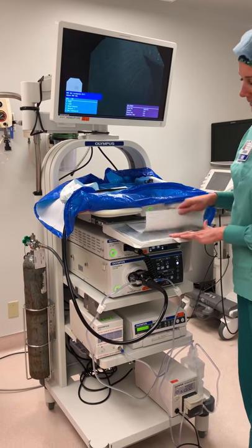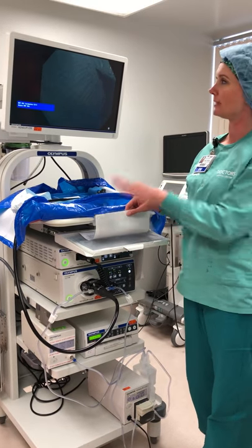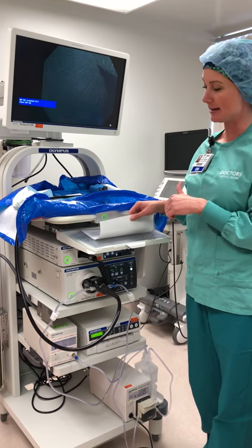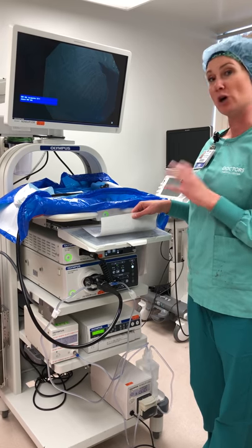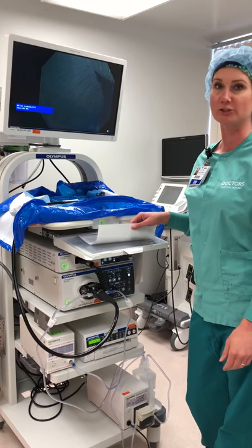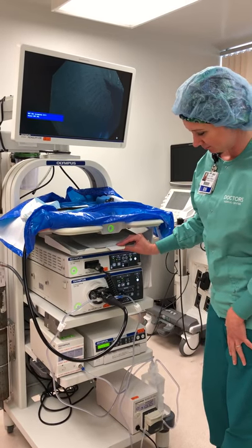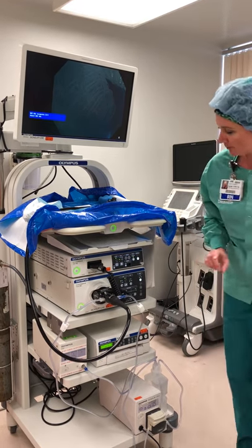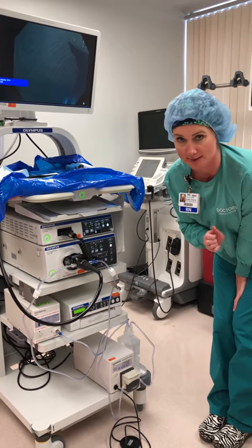The top of this cart has a pull-out keyboard so you can type your patient's information in if you want it to print on the pictures. If you forget to do that, you can always use the patient labels and put them on the pictures when you're done.